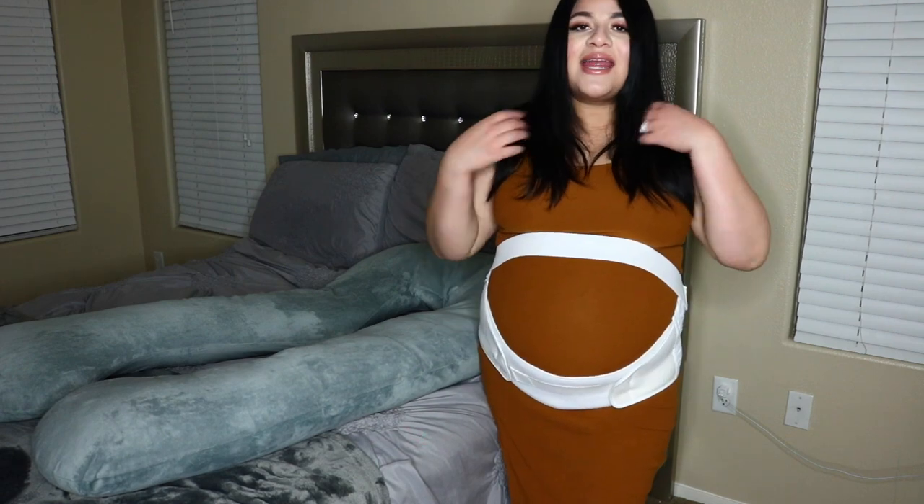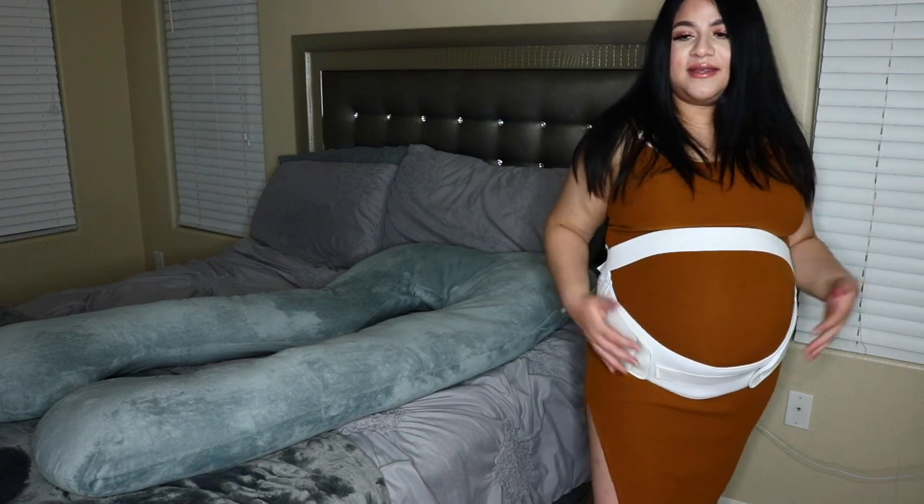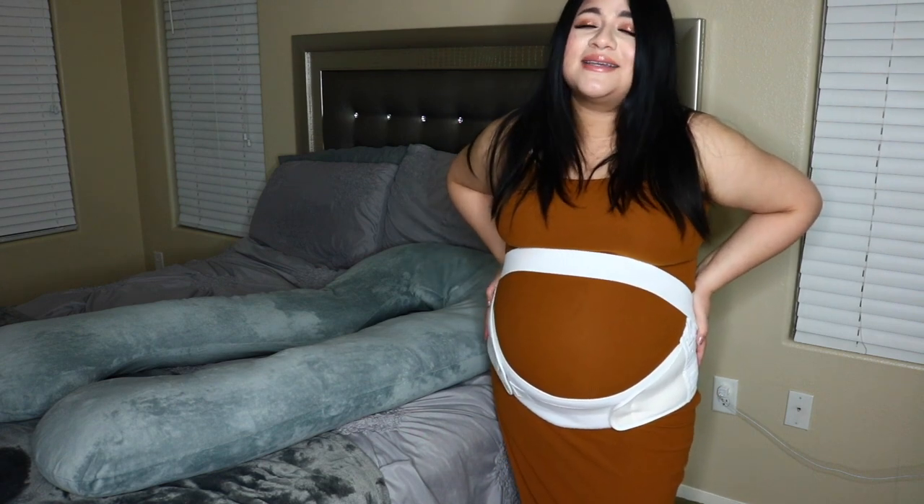And this is the maternity belly band. This is the support that y'all need if your belly is super duper heavy. I love this thing — it totally changed my life. I'm being really dramatic, but it's really good. I totally recommend it.